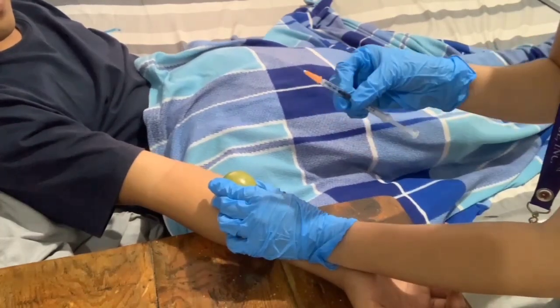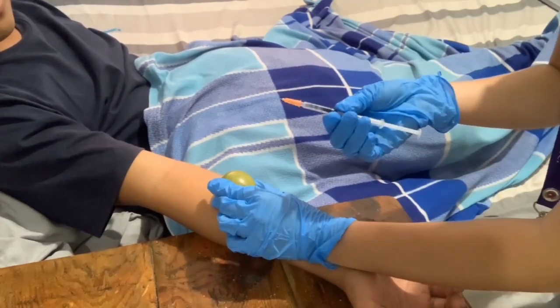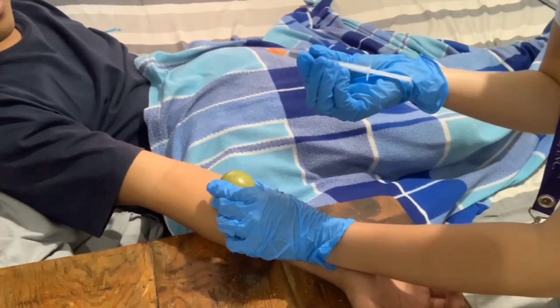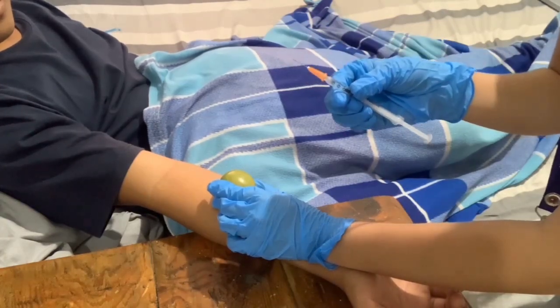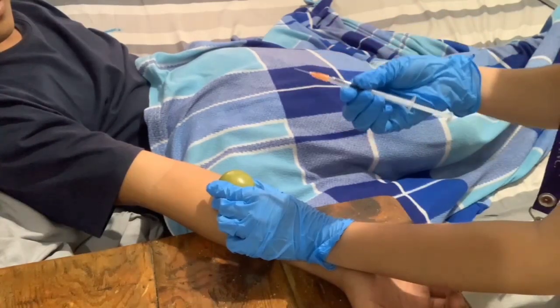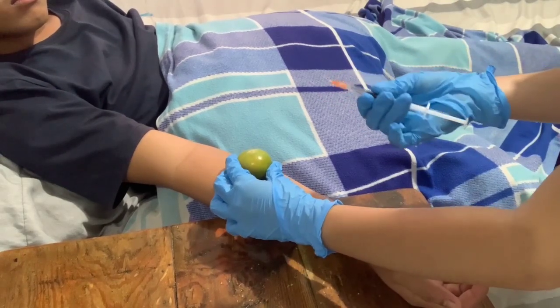So now we are going to grasp the syringe with our dominant hand close to the hub, holding it between the thumb and the forefinger. So this is my dominant hand, which is my right hand. So now I'm going to hold the needle almost parallel to the skin surface with the bevel of the needle up.